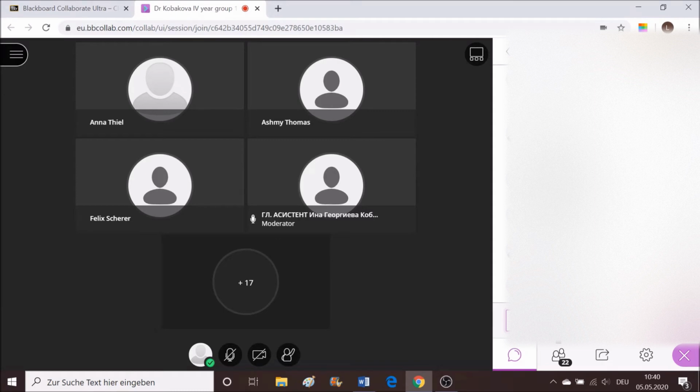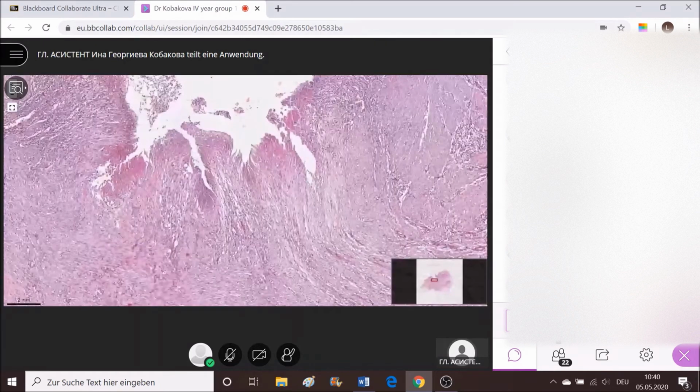Do you see it? Again, you lost it. Okay, I will share it again. Okay, and what else?